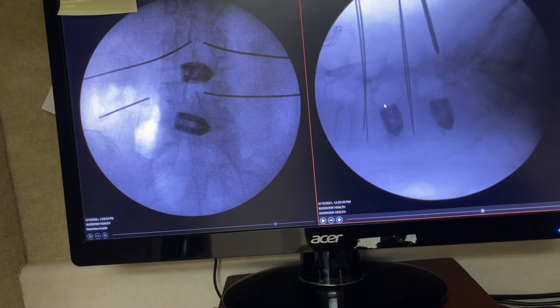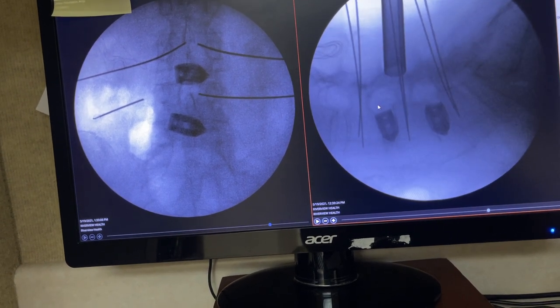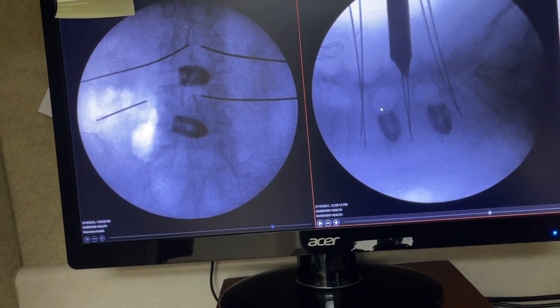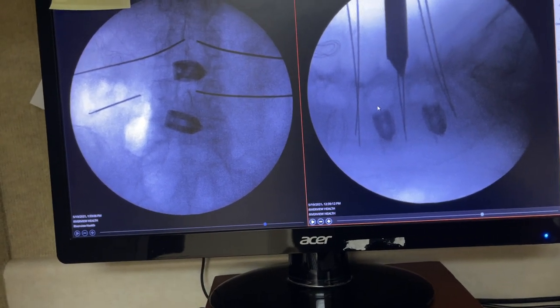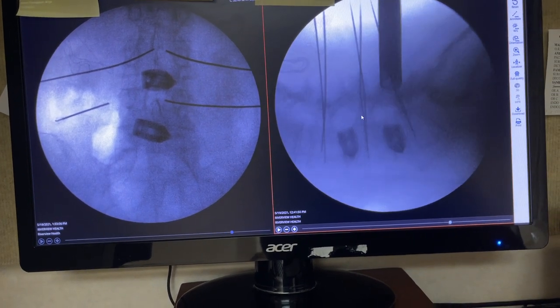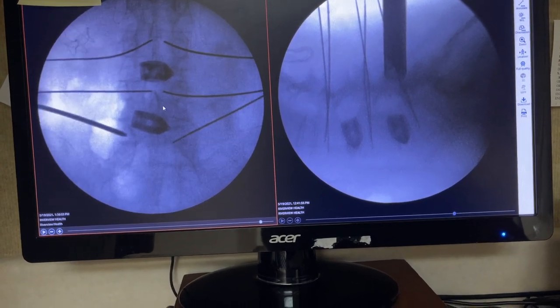The rest of it is putting pedicle screws in at all levels. Once the six pedicle screws are in, this is the decorticator where we go in, center it — it is eccentric, meaning once it is in, it is centered on the facet. We grind the surface of the facet and then pack it with tricalcium phosphate on both sides. Obviously you won't see that here anymore because the AP machine has been removed at this point.